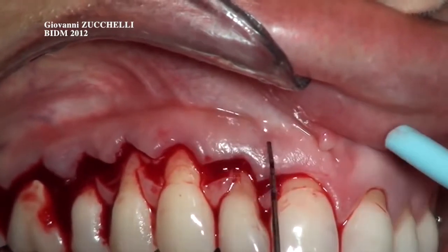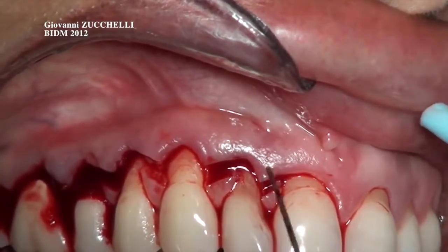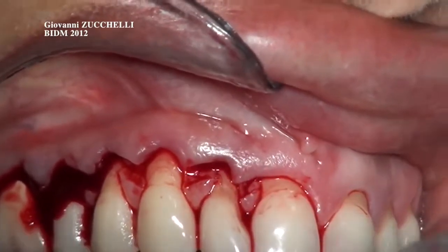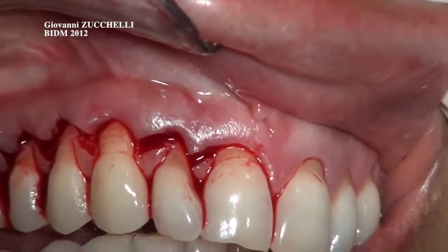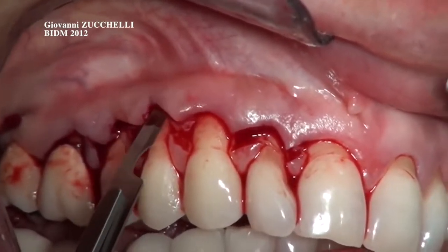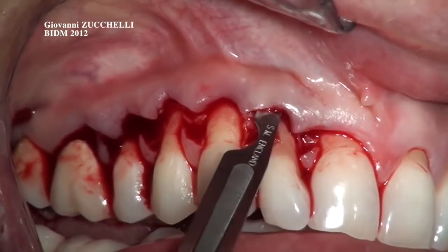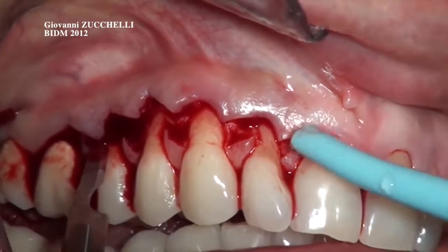The first thing I have to do is to eliminate this angle in order to be able to go with my probe and consequently also with my knife parallel to the lining mucosa. So the first incision we are going to make is a deep incision, which is used parallel to the bone, and this is used just to eliminate the muscle insertion in the depth of the periosteum.